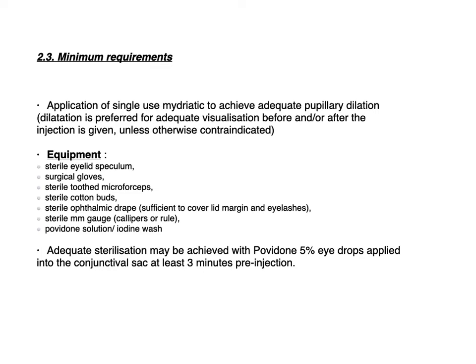The first step is the periocular sterilization by adding 10% betadine and to wash the conjunctival sac using 5% betadine for 3 minutes as recommended by all guidelines.